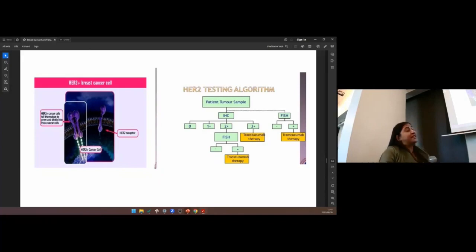Well, what we need to find out is, is there truly HER2/neu amplification? These are often on our HER2 2+ cases, which is equivocal. Now, this could be immunohistochemical assessment, this could be subjective pathological assessment, but very frequently we will send it off for HER2/neu testing, and then we will get a diagnosis of whether it's amplified or not.